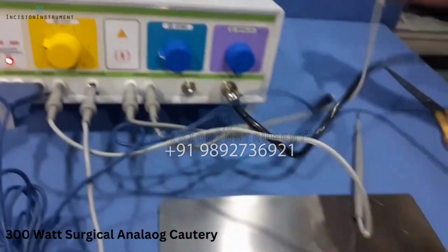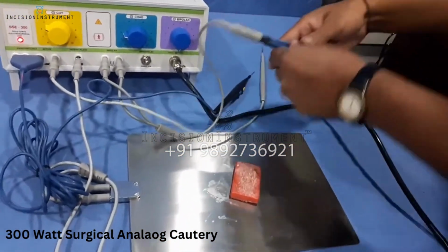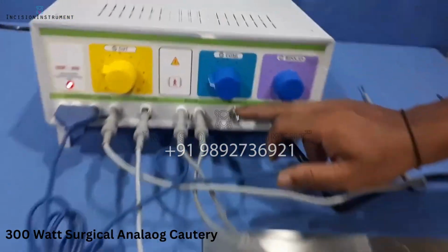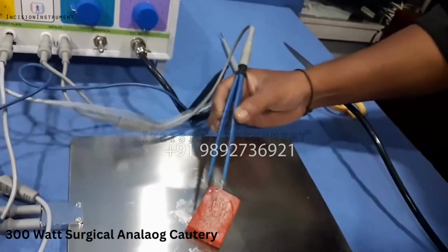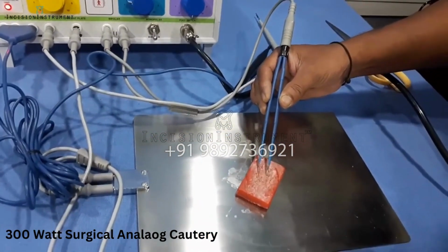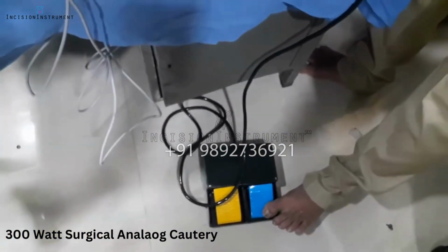When you are using a bipolar, you have to switch the machine to the bipolar mode, which was on the monopolar. You have to go into the bipolar, and you can control it with the forceps here, and you have to operate it with the blue pedal here for the bipolar, which is provided.